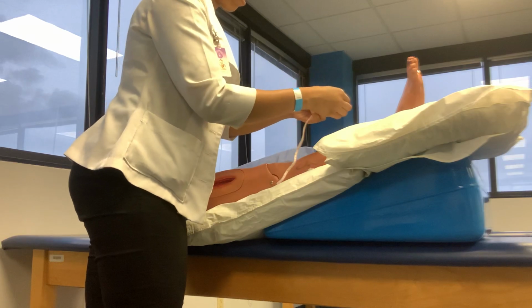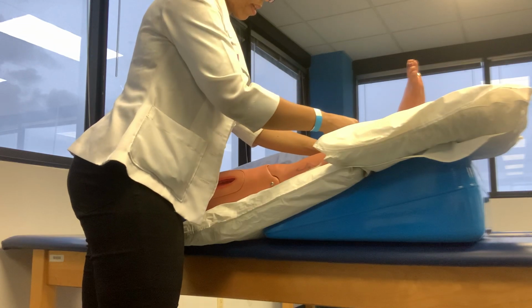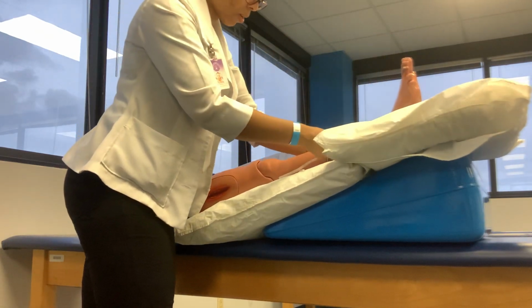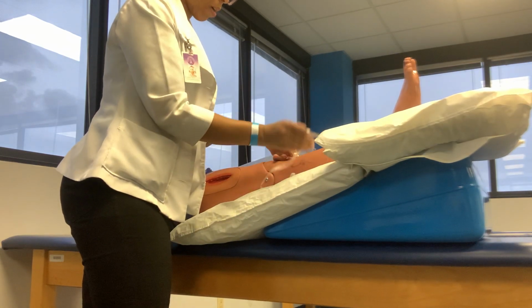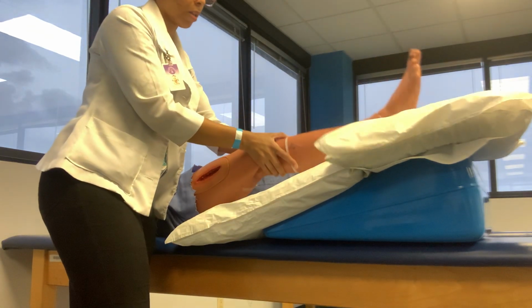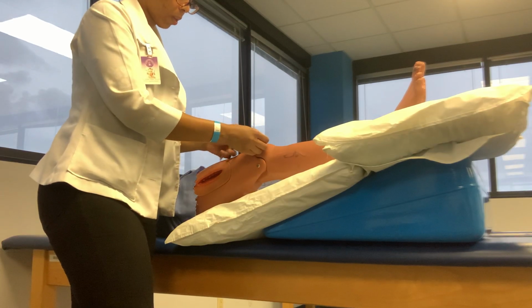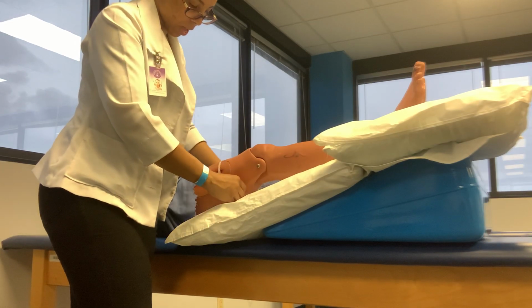From the ankle, we do 6 inches up and take a girth measurement, right? So we go 6 inches from the ankle, take a girth measurement. Do another 6 inches from there. So we're at the upper leg. Take a measurement. We measure at the knee. And we do 6 inches above the knee. So we're at about mid-thigh.